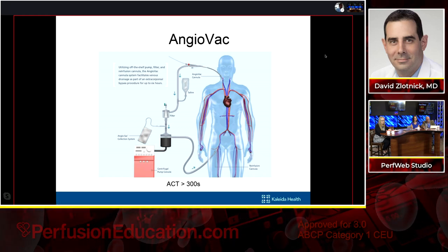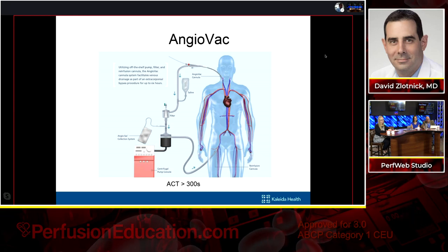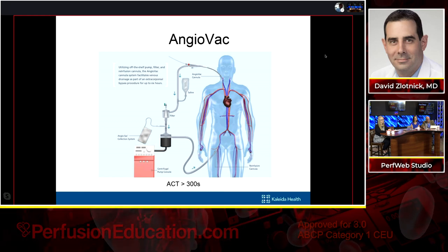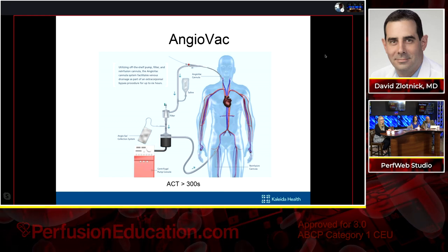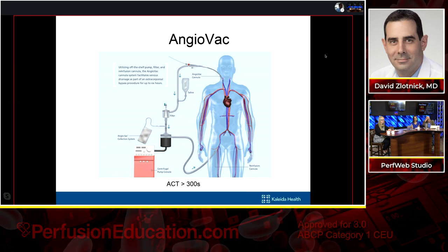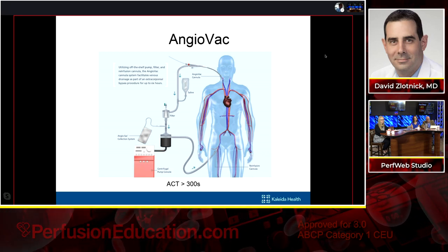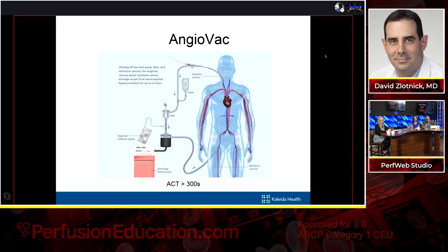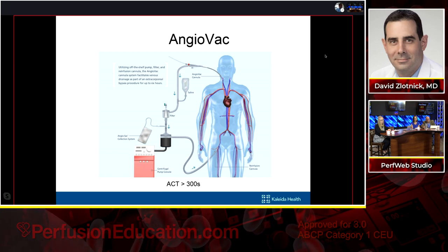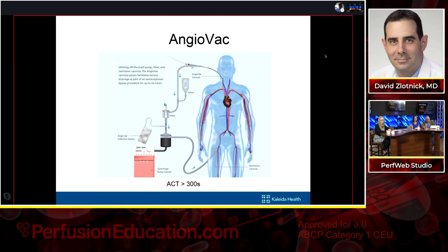So this is the crux of how we think about these cases: have this as our starting point, figure out where we're going after and what our access sites are going to be. We've recently done our first LV case. I don't want to get too involved in that, but in order for us to have suction aspiration from the left ventricle to maintain stability while we're dropping the cardiac output, we had to actually do AA access, so return the blood through the femoral arterial system to maintain stability. But for the majority, 99% of cases, venous-venous access is where we're going.